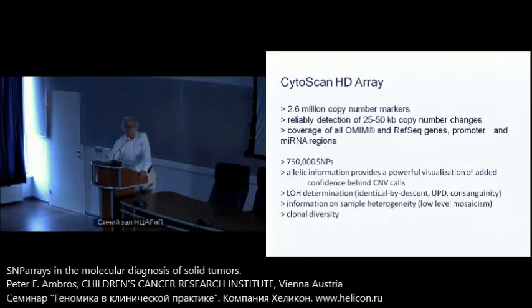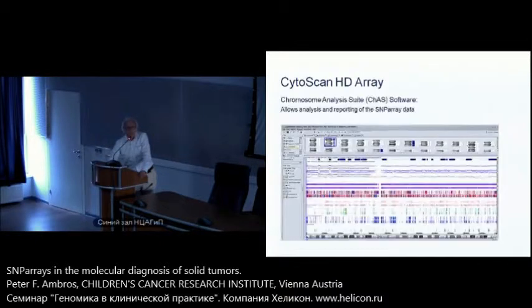I don't want to go into details you have seen. We are using the CytoScan array since more than a year, and I'm really happy to have this tool in hand. You have also seen the software to analyze the data.